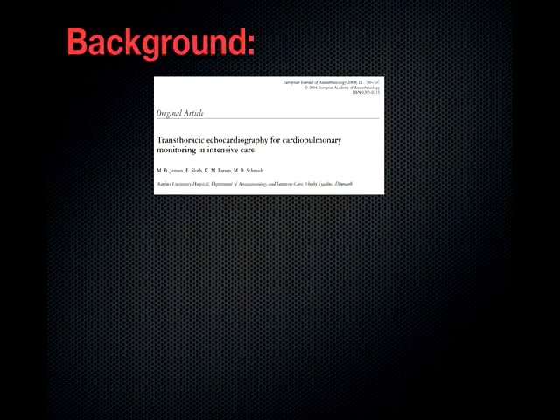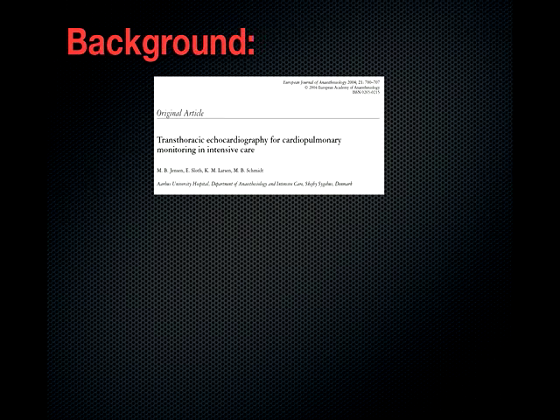Some background about the F.A.T.E exam. Originally in 2004, this exam was described in Transthoracic echo for cardiopulmonary monitoring in intensive care. This was a study where they taught intensive care physicians how to use the F.A.T.E protocol and then had them incorporate the F.A.T.E protocol into their daily routine, and they studied the outcomes.